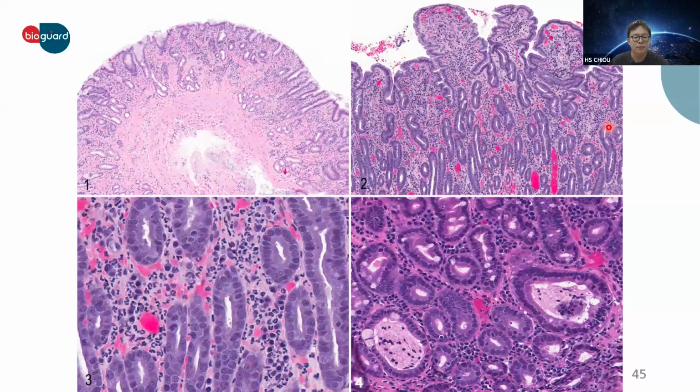And figure 2 is the duodenum. Here we see diffuse moderate blunting and shortening of villi. The villi profiles are clearly atrophic. They are not tall and finger-like anymore. Again, this reflects structural damage, not just cell infiltration.